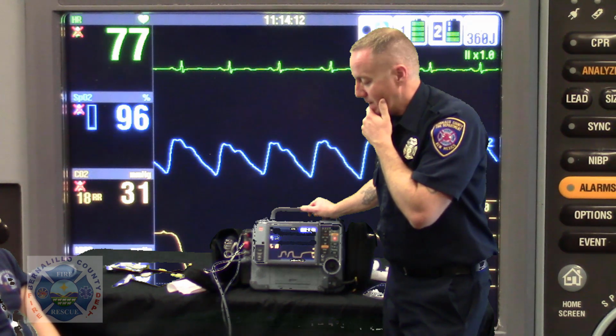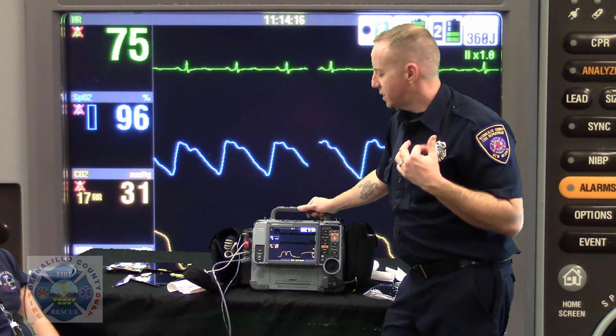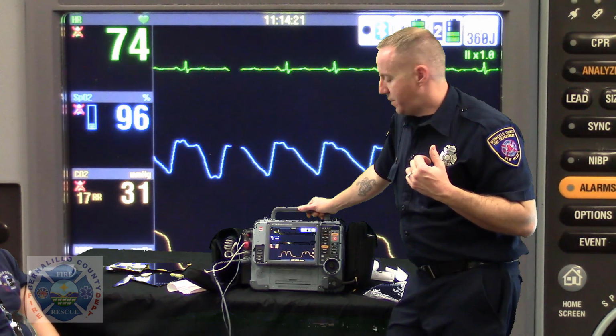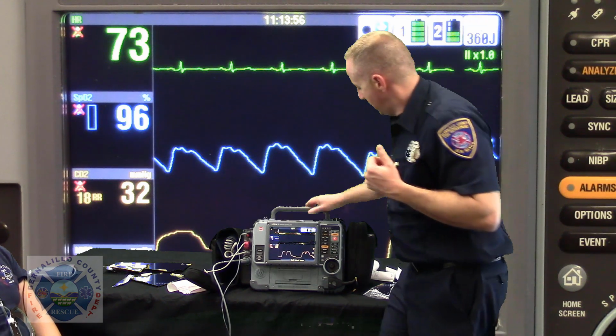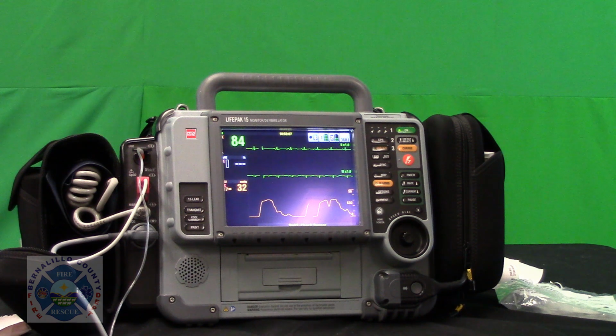So, end tidal. Now, the critical patient who you've now introduced an extraglottic airway or an intubation or something on, there's a whole lot more considerations with intubation or airway monitoring that you're going to want to employ.